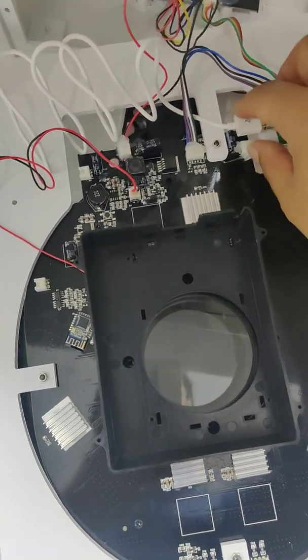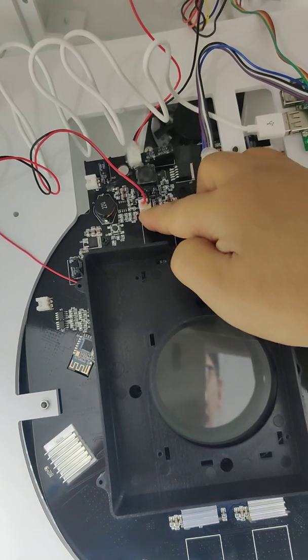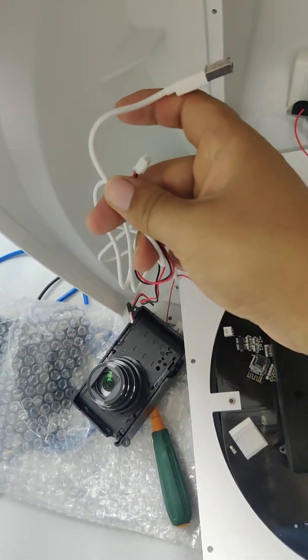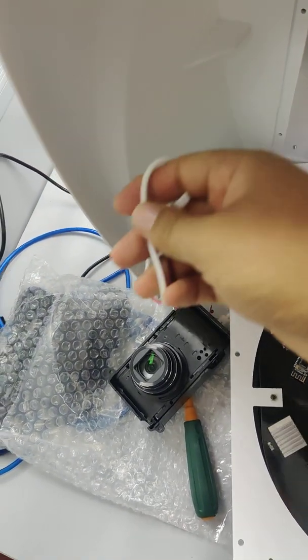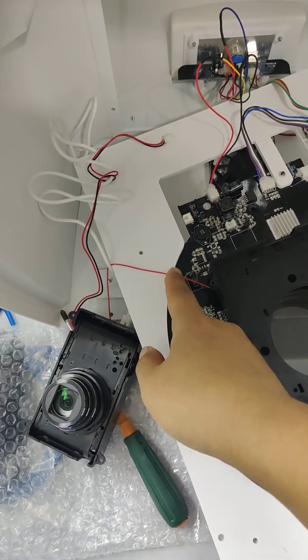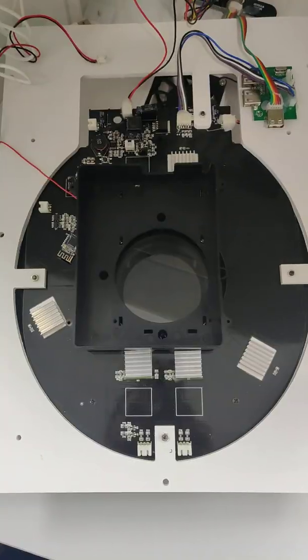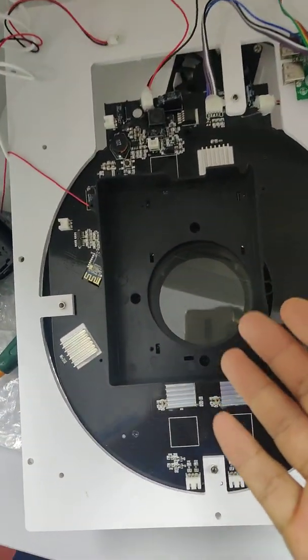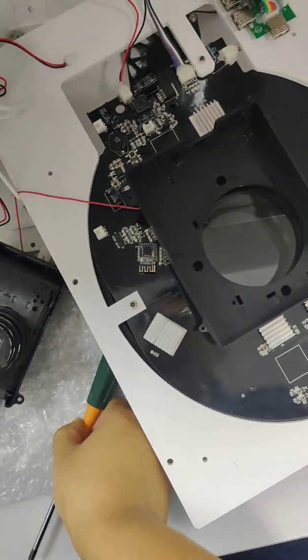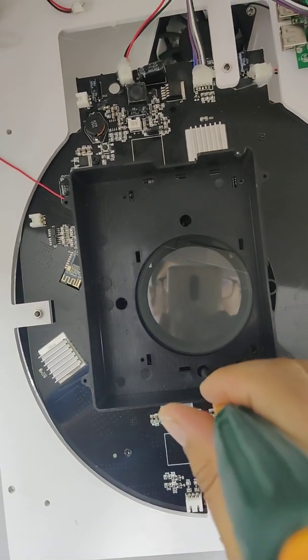So now we can take off this cable and this cable. You can see I already take off these 2 cables which connect to this camera. Now we need to take off this cable from this panel. But it seems like we have to take off this plastic shell first. So we need to take off these screws.